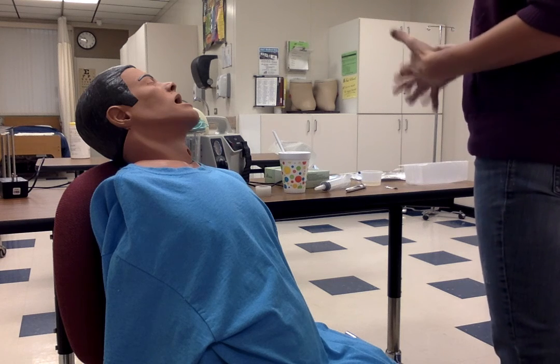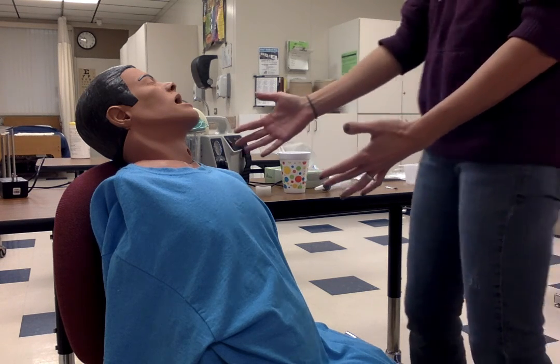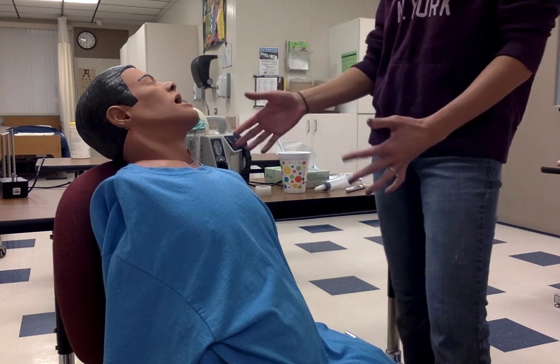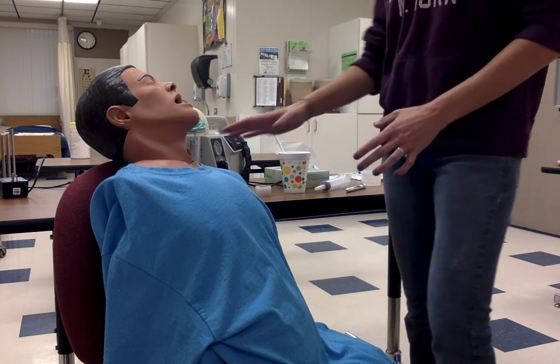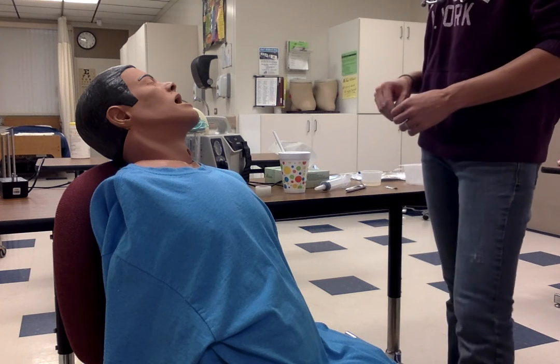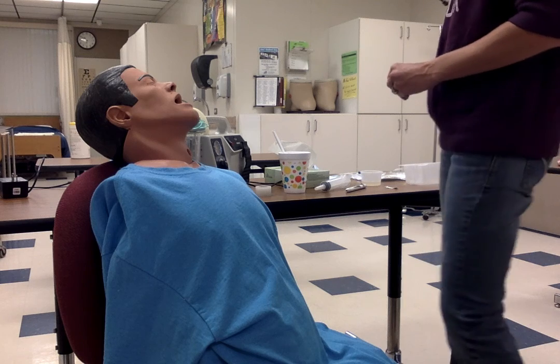So looks like I have everything here that I need. You would want to make sure that your patient is not laying flat for this procedure. You want him sitting up as best as you can here. So I have him propped. We don't want him falling here, so I have him propped on the chair for demonstration purposes. So we will go ahead and get started here.